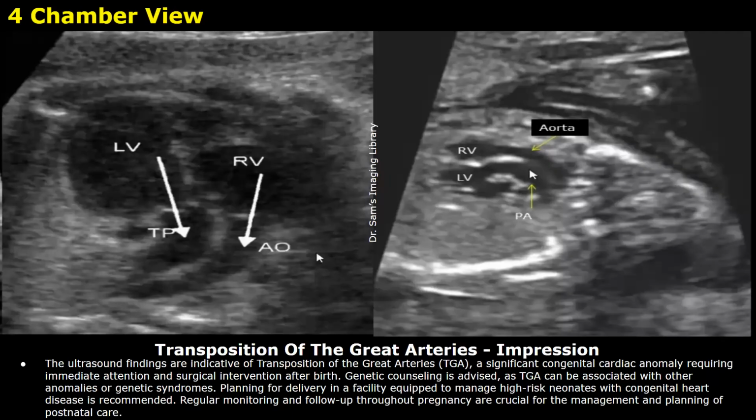Genetic counseling is advised, as TGA can be associated with other anomalies or genetic syndromes. Planning for delivery in a facility equipped to manage high-risk neonates with congenital heart disease is recommended. Regular monitoring and follow-up throughout pregnancy are crucial for management and planning of postnatal care.